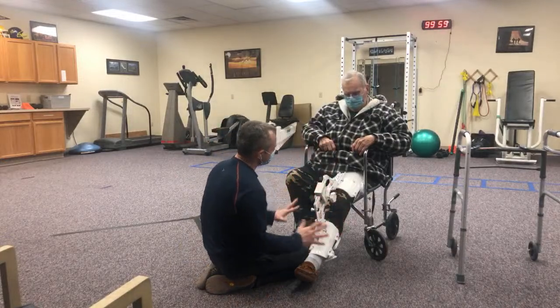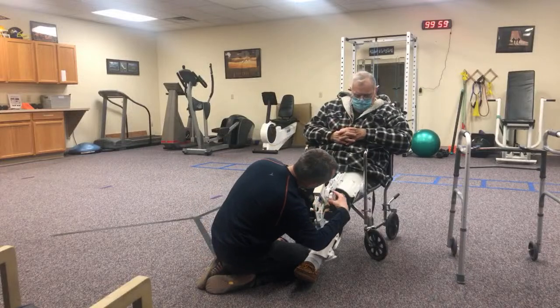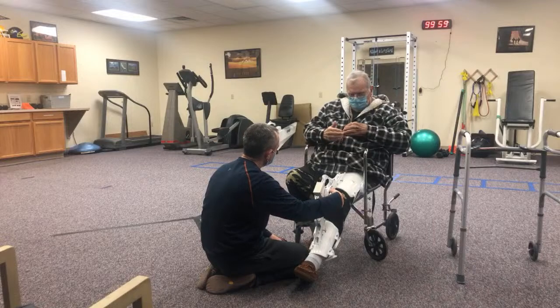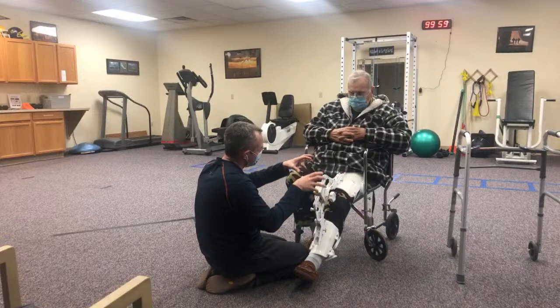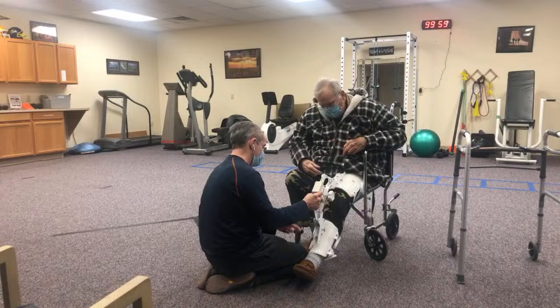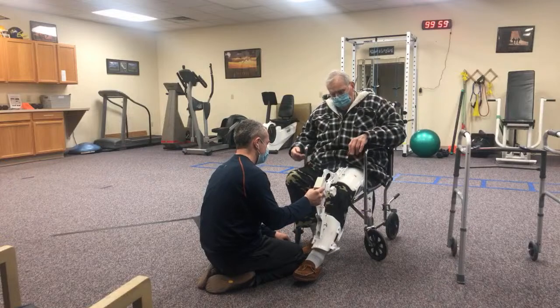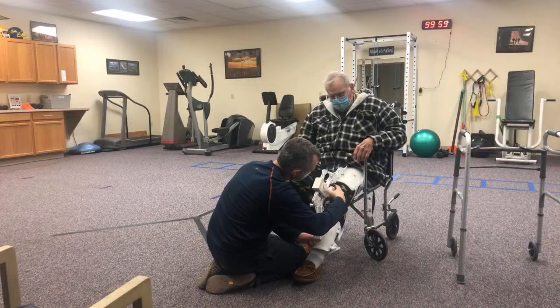It's not exactly where we want it yet, but that's okay. As I twist it, you're going to feel a little bit of pressure. As I turn this, it's working on the bend. What I want you to do - I'll kind of support it - go ahead and bring your foot back toward you just a little bit. Yes, this foot. That's it, and then stay there.